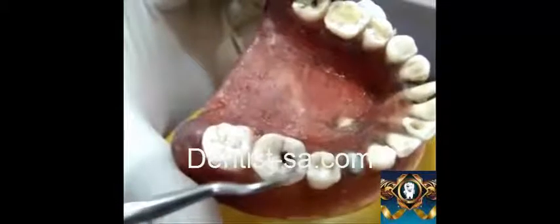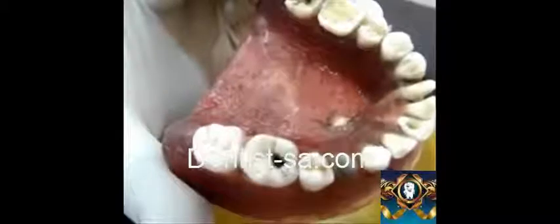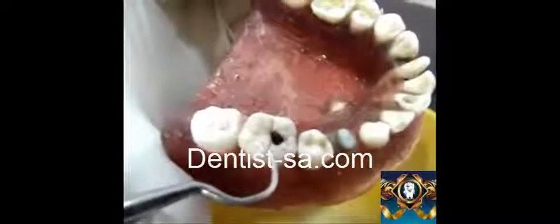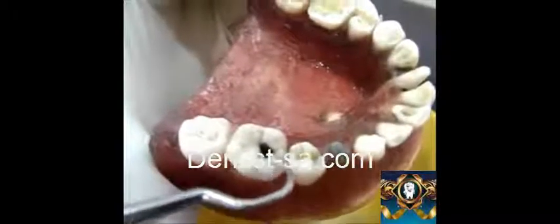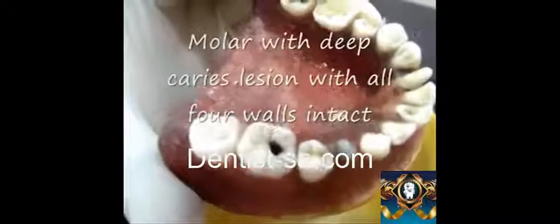Indirect pulp capping is mainly done with deep caries lesions — deep caries lesions that are threatening to involve the pulpal health and integrity of the pulp. For this pre-clinical procedure, you are required to have a molar with a deep caries lesion with all four cusps being intact.